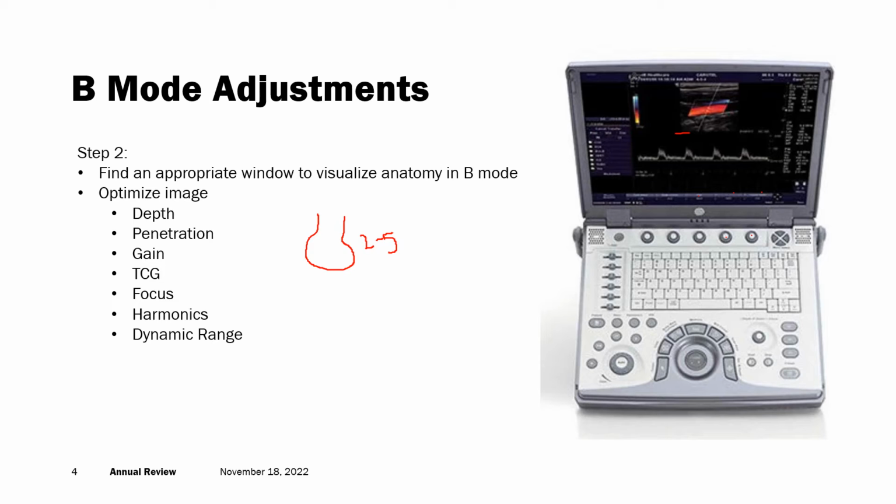On the other hand, there are other manufacturers that don't give you that direct approach. They'll have something called general, penetration, and resolution. When you're in the general setting, you'll be scanning kind of at the middle of the two ends of megahertz. When you're in the penetration, you're going to be scanning at the lower end of those megahertz. And when you're in the resolution, you're going to be at the upper end. So some of them, like Philips, will have a more indirect selection of penetration.